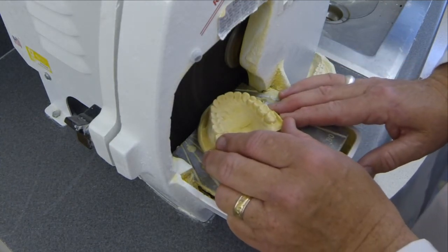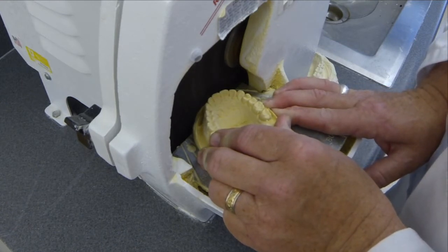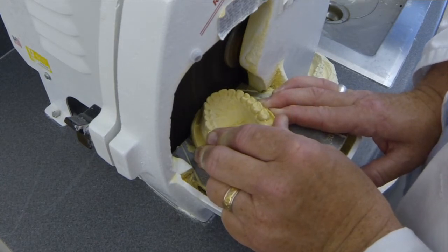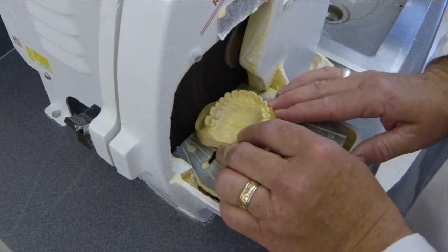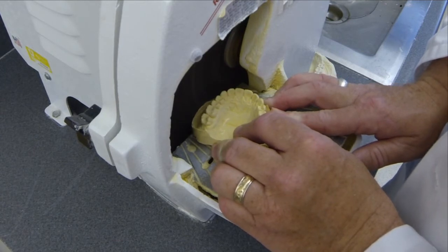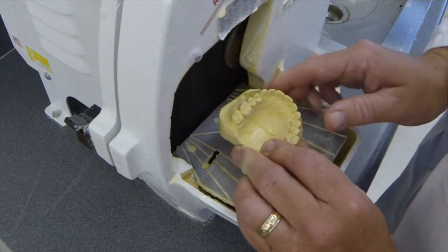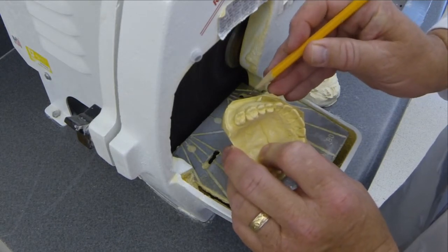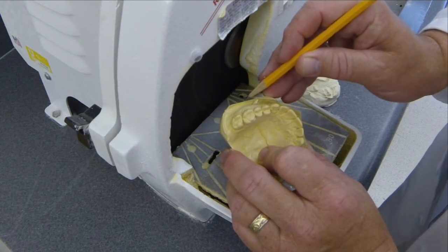We follow the same plane on the other side now. Cuspid to central embrasure or midline. Watching the lateral incisor so that it doesn't get too close. And now we'll do second molar to cuspid. Again, because of the extent of the buccal bone in this area, we're only going to trim to this point because we still want to have a 1 millimeter depth and a land area.